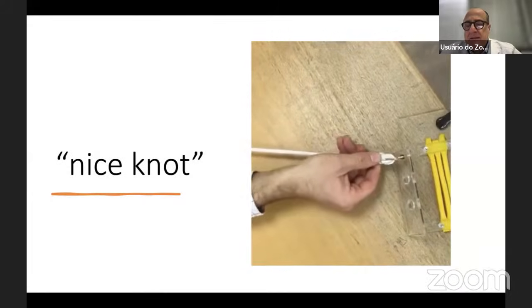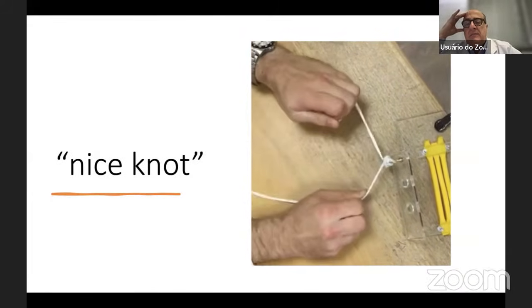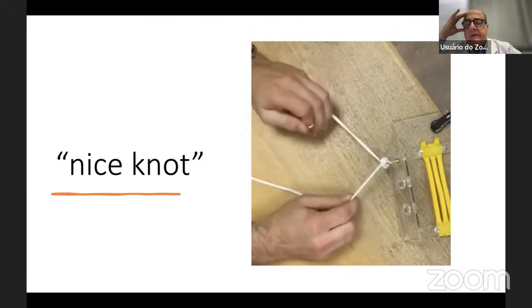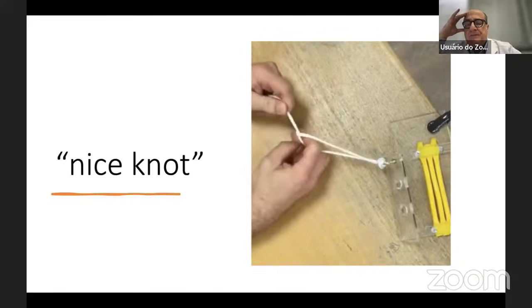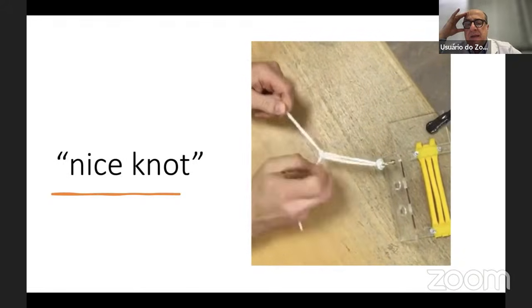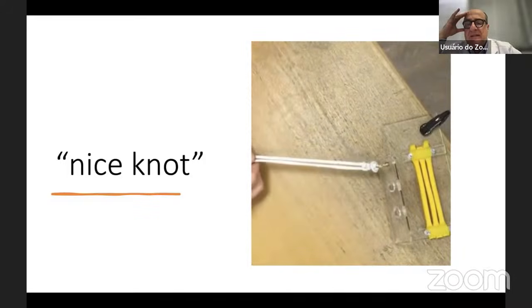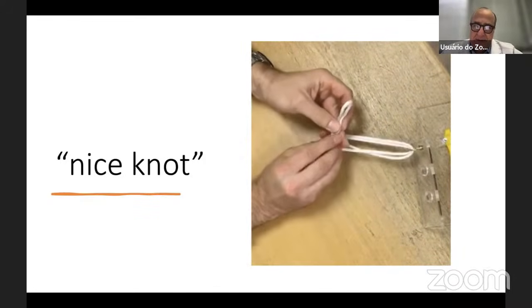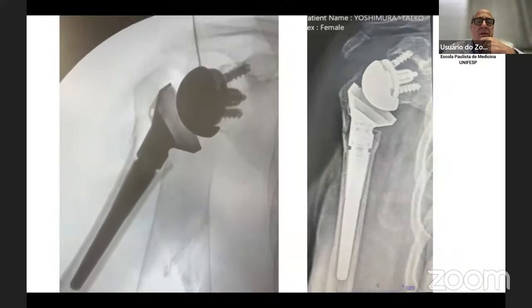We slide it, and it gives a very good fixation. And then we make some half stitches to make it blocked, and that is a fantastic way of doing this. This is the post-operative result of that case.